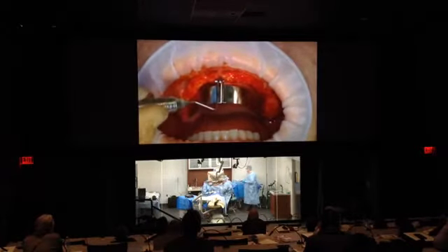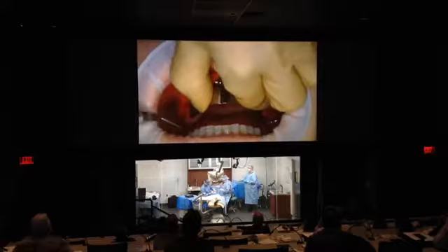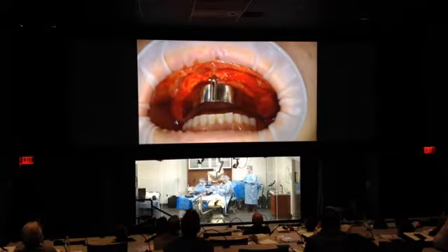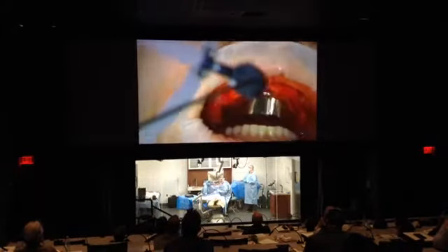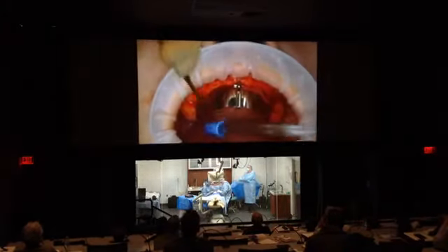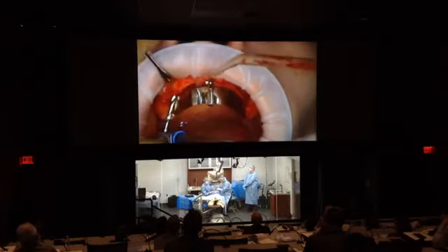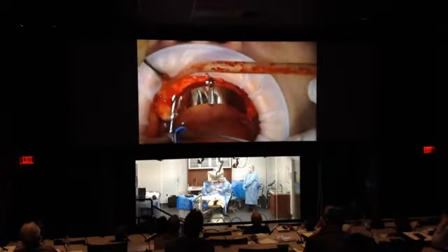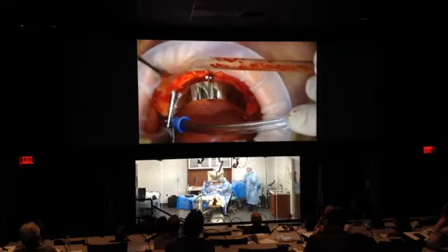Okay, so I'm checking again. This is right in the midline. It's stable. And again, you can pinch the sides to be able to see the ridge. So we're going to start on the right side with the distal most implant. I'm going to start again. I already started my point there. I'm going to turn your head a little bit this way, okay? Perfect. So right there, that's the entrance. It actually happened to match exactly with the line on the All-on-4 guide. And I remember from checking in the clear guide, the replica of the denture, that this is a good position for that.